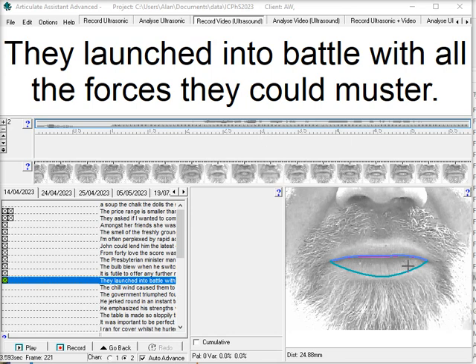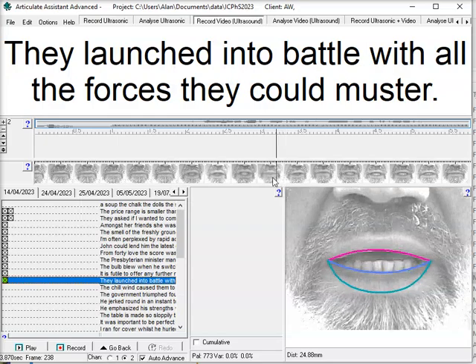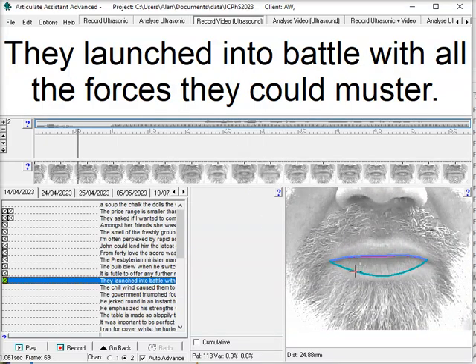We've got some lip video and we've run the DeepLabCut lip splining so we can see the lips moving. However, if we drag the cursor from the top to the bottom of the display, we can see at the bottom here that it says that distance is 24 millimeters.